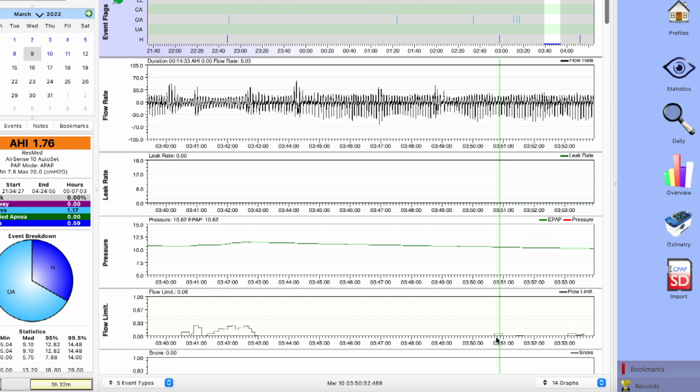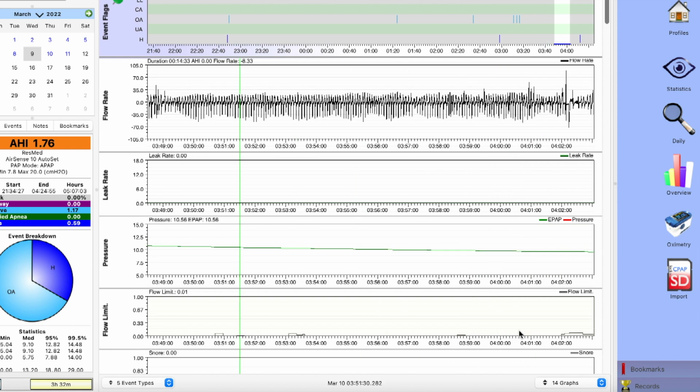Until, look, over here, finally it picks up more. And it continues to go down. So how can we trust this algorithm? Why is the algorithm for her, or the standard algorithm, why does it even matter? It's not doing what it says it's going to do. It's not as advertised.